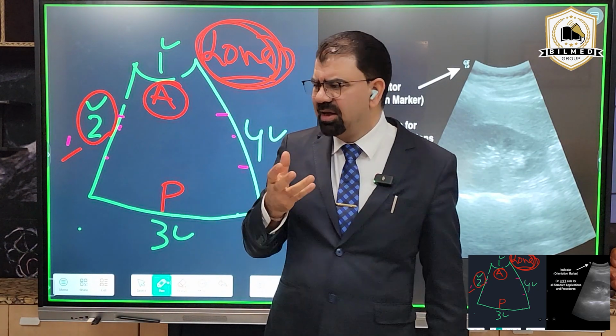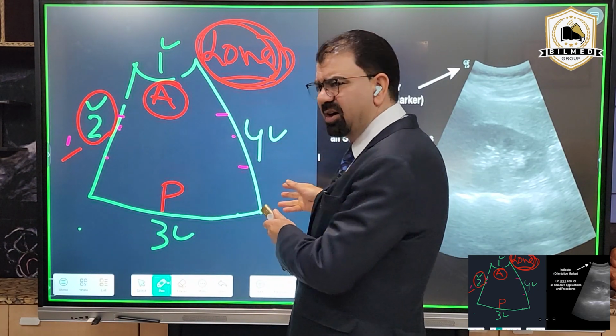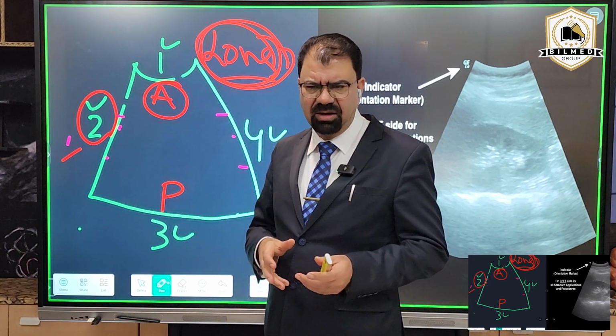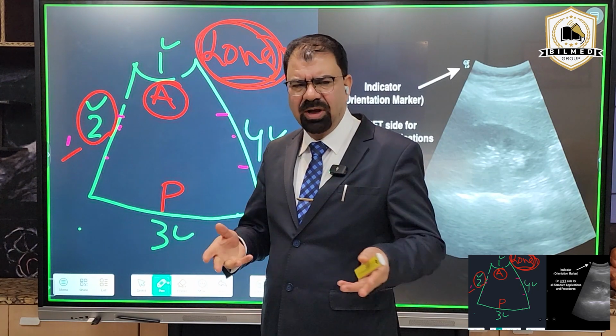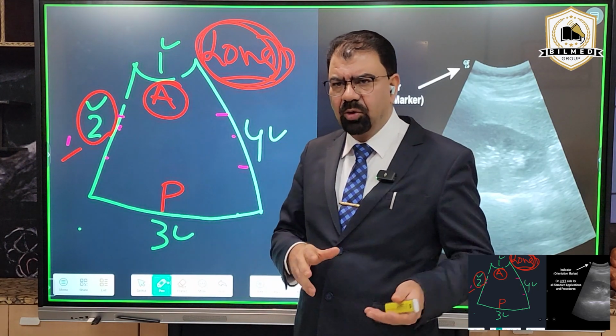Unless and until you have a clear understanding of probe, marker, and screen orientation, you will always struggle with this ultrasound. And irrespective of how much money you are spending, this money is getting wasted because you are not properly interpreting the image and knowing your knobs.